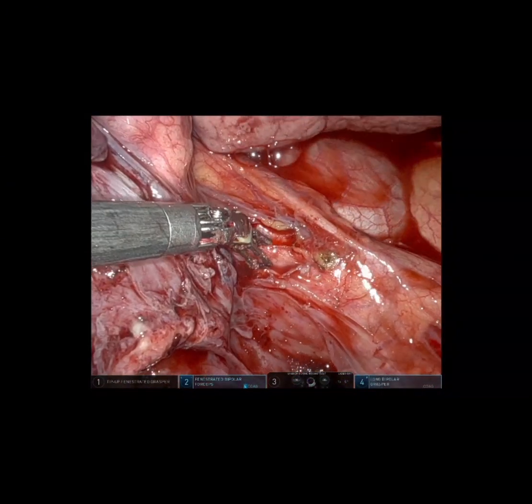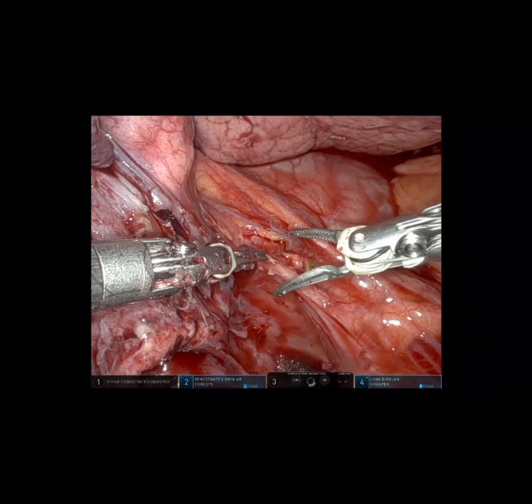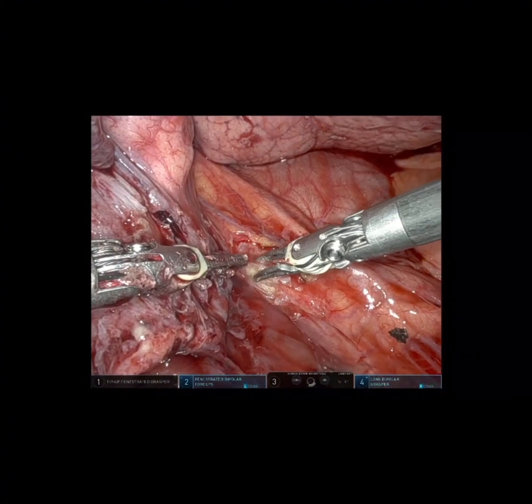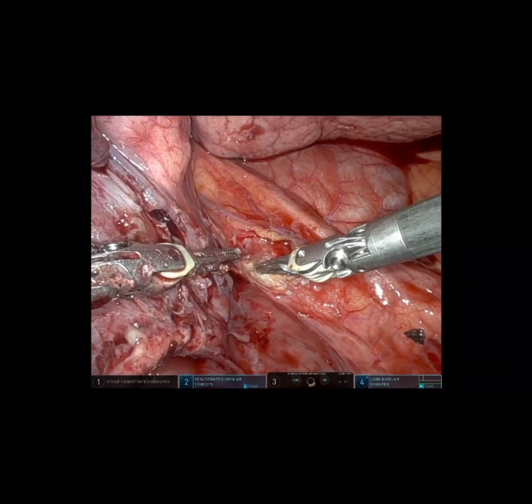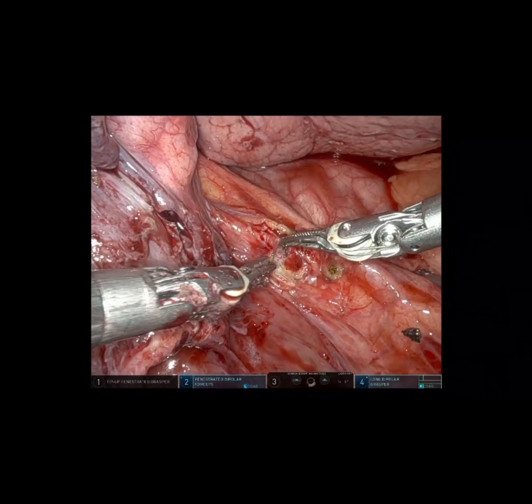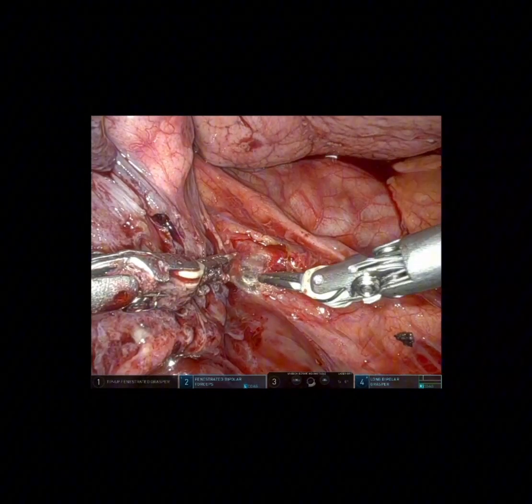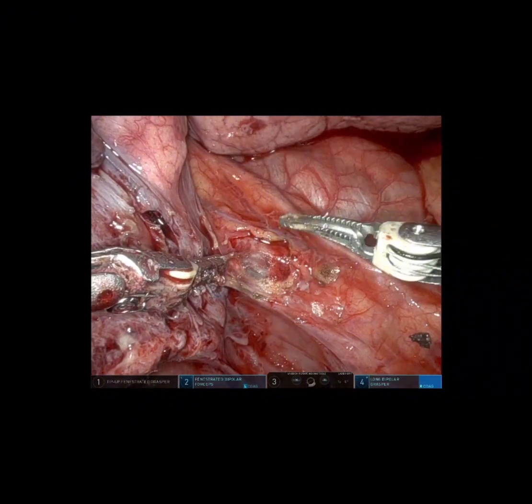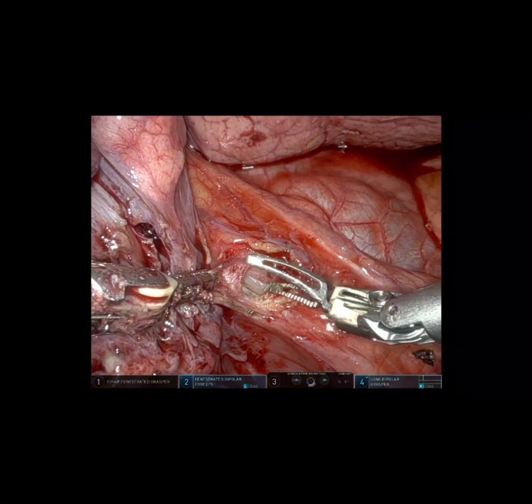So now we're going to open the pericardium. There's the phrenic nerve. We now go to a bipolar instrument, which is what we like to use pretty much exclusively for routine lobectomies. We don't use the spatula or a hook. Open up the pericardium. There was question of tumor involving this vein. You saw in the first CT scan with contrast, there was almost invasion here. But after neoadjuvant therapy, it got a little bit better. And we're going to demarcate the vein and then quickly get around that.